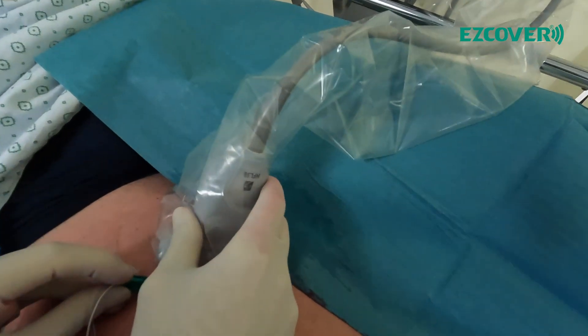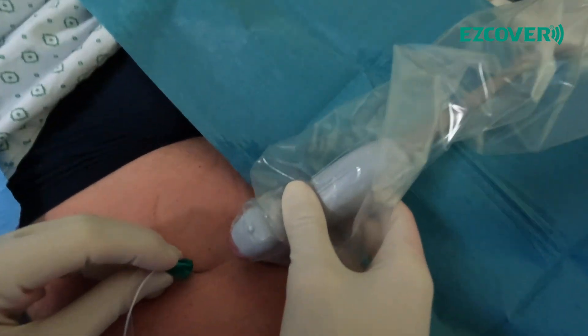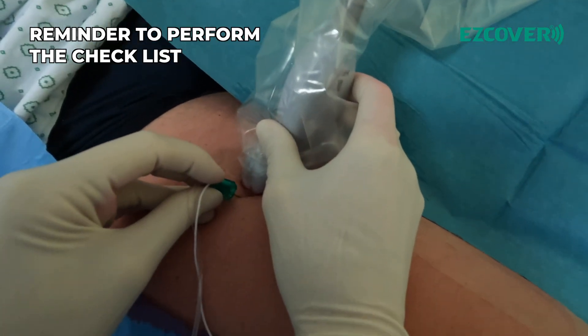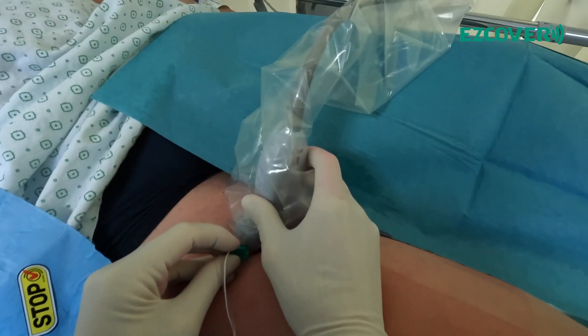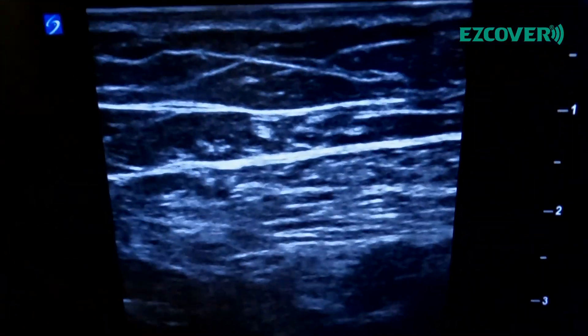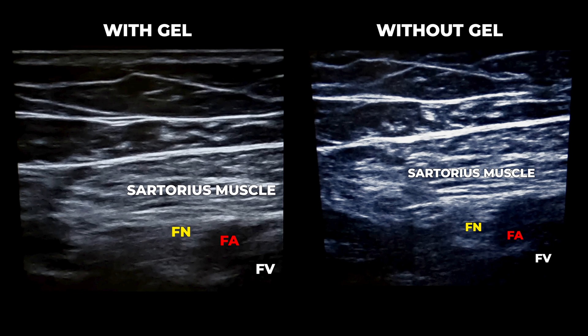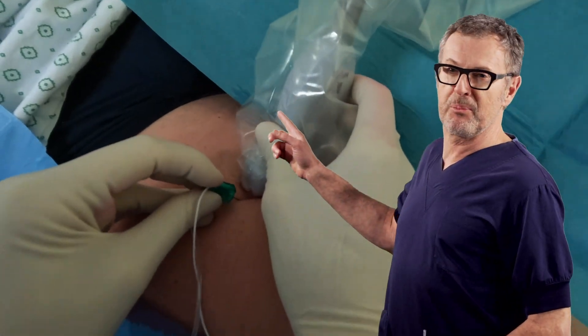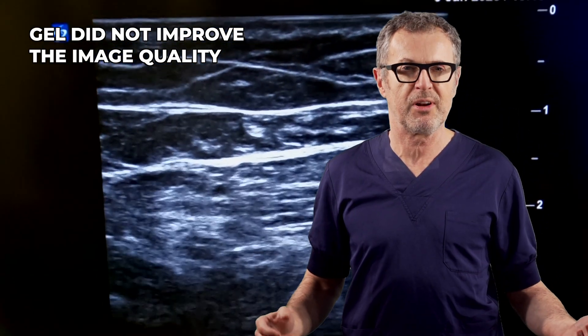Let's now check if the application of gel makes the image any better than the image without gel, just using local anesthetic. See if we get any better — it's the same, no much of a difference. So you don't actually need gel. Clearly, the application of gel made the procedure messier, but it did not improve the ultrasound image quality.